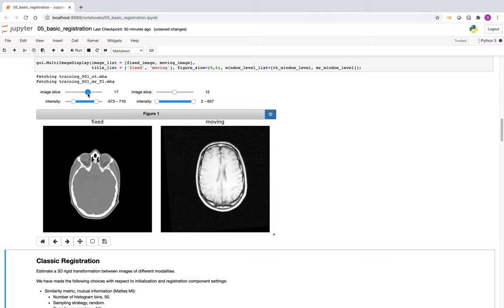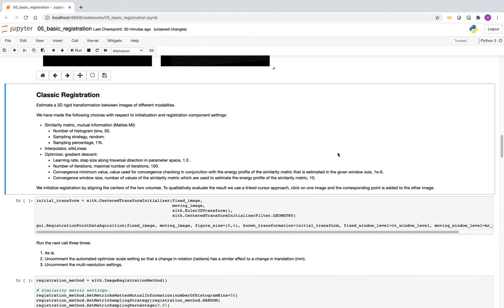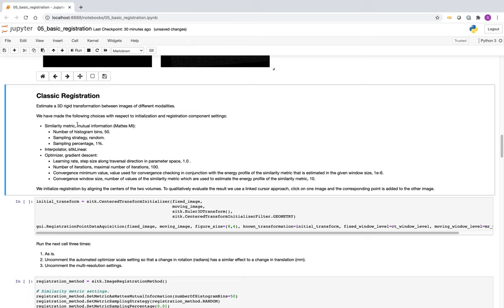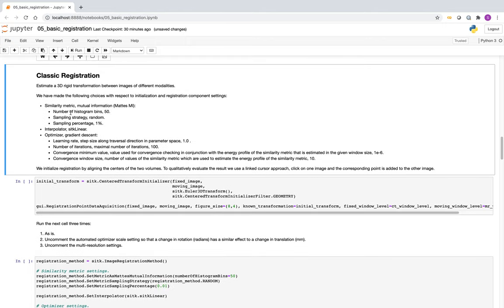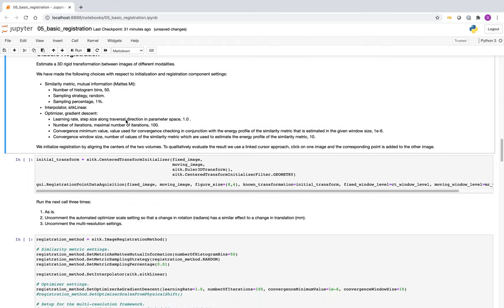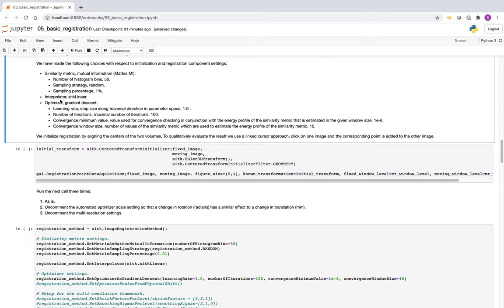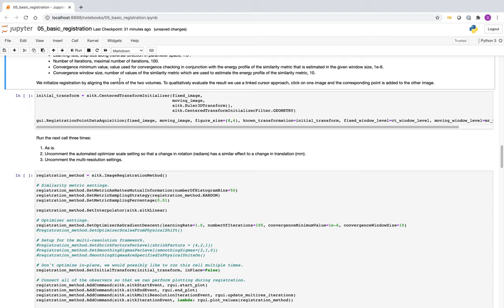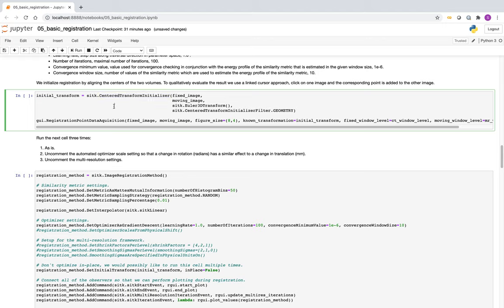We can scroll through the stack and see the various structures. We'll start with a classic registration approach. Because this is multimodal MR-to-CT registration, we use mutual information as the similarity metric, with 50 bins for estimating the probability density functions. Our sampling strategy is random, and we sample just 1% of the data — that's all we need. We use a linear interpolator, a gradient descent optimizer, and since we don't know any better, the center transform initializer, which aligns the centers of both volumes.